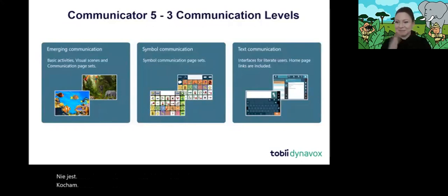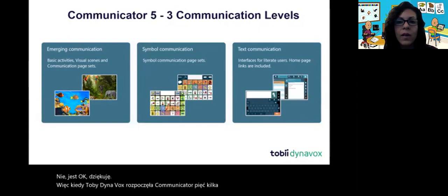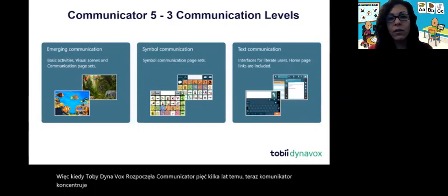Thank you, sorry. No, it's okay. Thank you. Okay, so when Tobii Dynavox launched Communicator 5 quite a few years ago now, Communicator focused on a very wide range of communication levels.